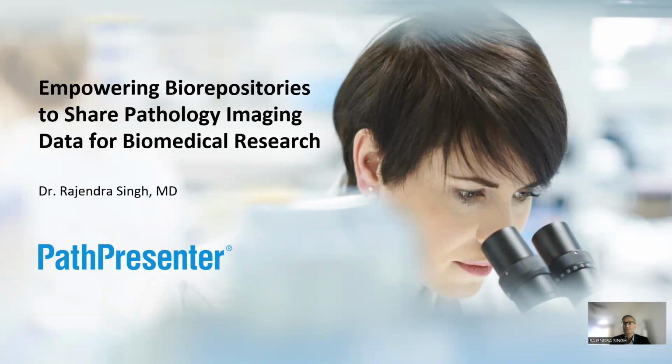As you are all familiar with Path Presenter, it has always been the goal of Path Presenter to create value and efficiencies for pathologists and pathology departments and organizations. We did that with the education module, then with the clinical and the consultation module, and now we present a research module that will empower biorepositories created by organizations or standalone biorepositories to share pathology imaging data for biomedical research.